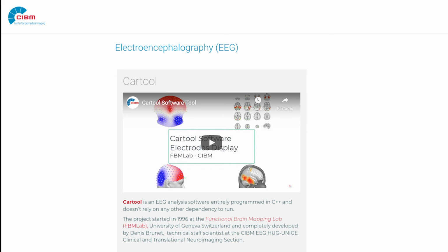Yeah, totally. The package can accept any gray mask you want and any solution points that you design. The default is to go through the predefined pipeline of Cartool, but in between this pipeline, you can plug in whatever you pre-processed, the MRI pre-processing, and of course the solution points. So you can give whatever solution points you want, but I assume that people doing that, so they kind of shortcut the pipeline, are usually experts, and they know what they're doing.